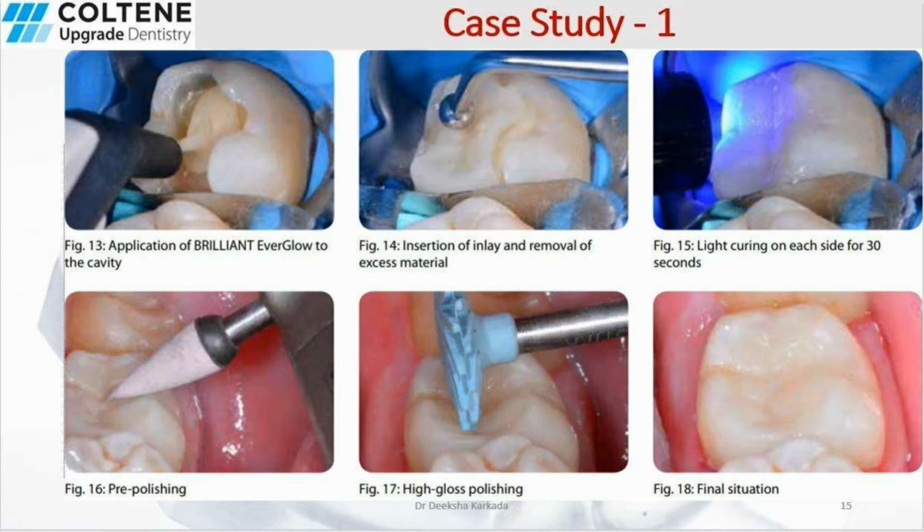It was cured for 30 seconds from each side, and then polishing was done using polishing tools to achieve the final look.